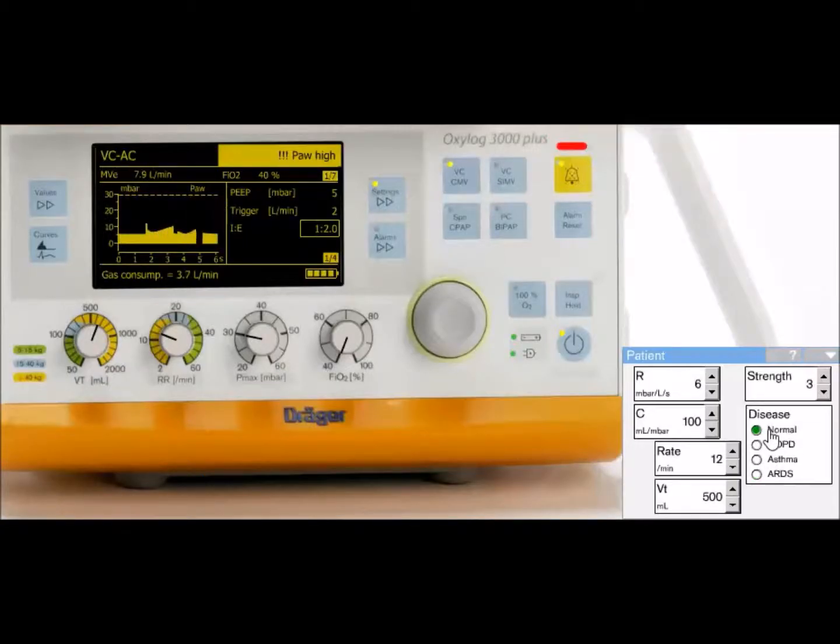And we also think about the lung protective limit as, is my tidal volume set too high or low, respiratory rate set too high or too low. And that's all inputs by the operator. It doesn't change when the lung mechanics change. And does this mode allow for automatic adjustment of tidal volume? And it doesn't. There's nothing automated about this mode at all.